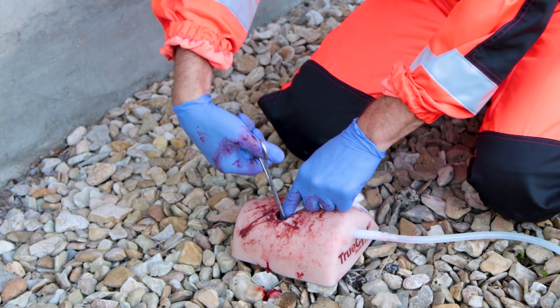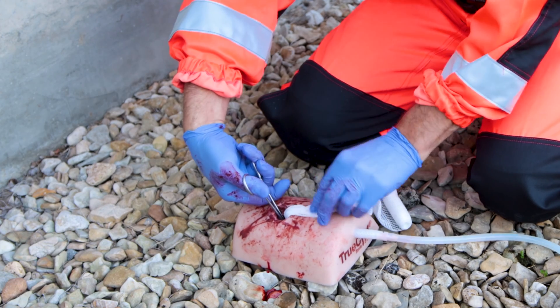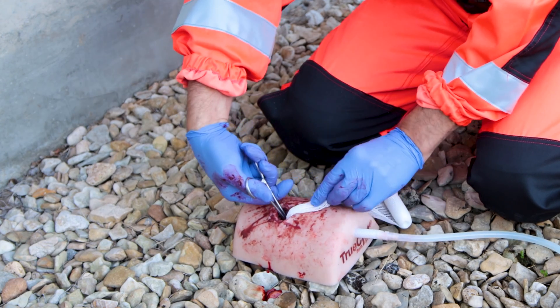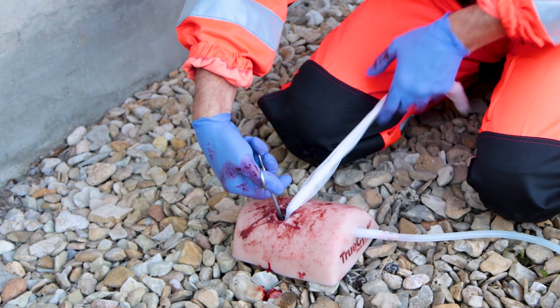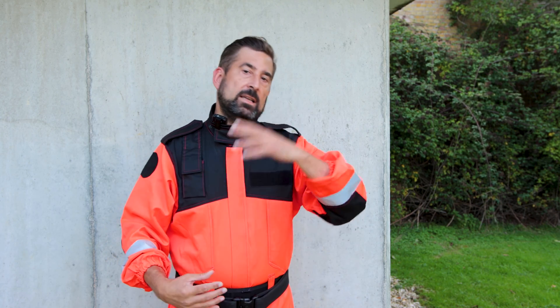You take a gauze, make a big knot in the end of it, and then just pack the wound as normal, using the forceps as your finger. Magill forceps do have limitations — like they won't help you find the source of bleeding — but they may help you avoid nasty injuries. So just weigh the risks versus benefits.